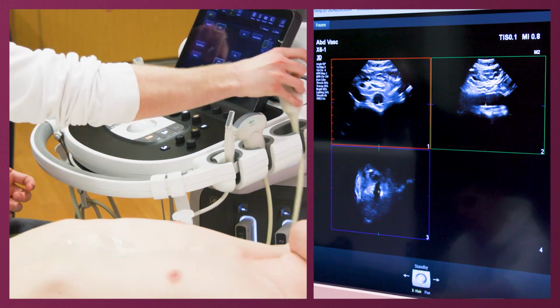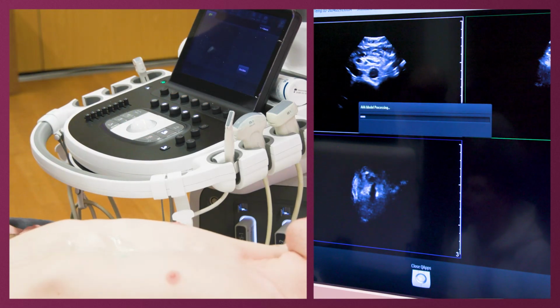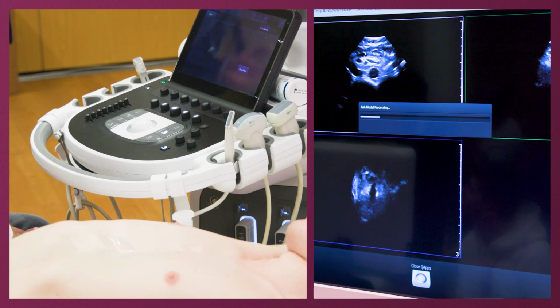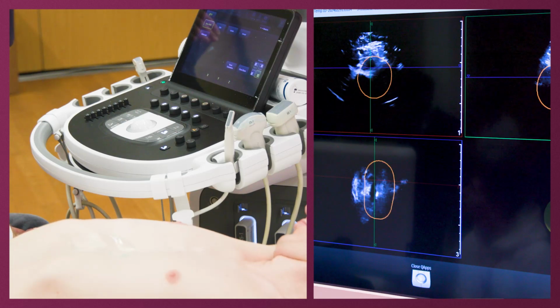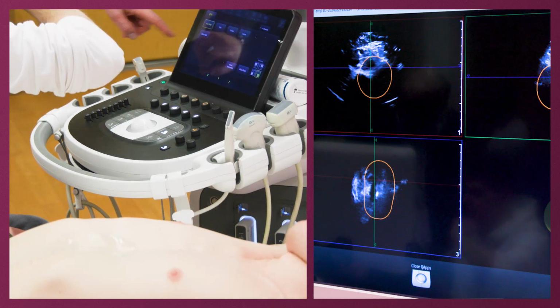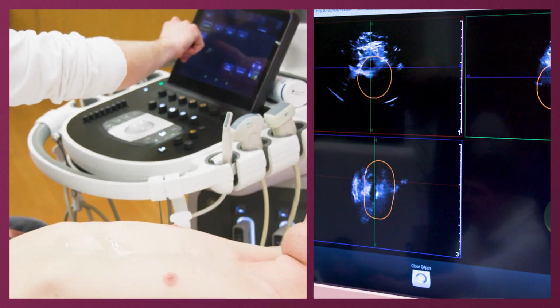Okay. And then you can put it back on the rack, and then you push the AAA, and you have to decide if you want it to be, at the moment, a virgin vessel or a post EVAR. Okay. Here you need to decide. You can just push down here. Okay, so there I put native. So this is native.